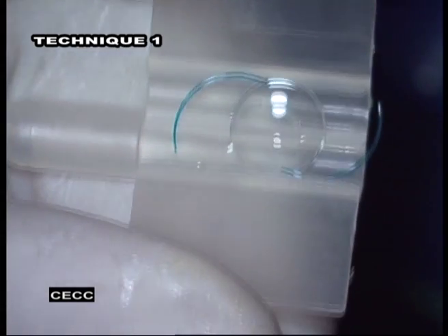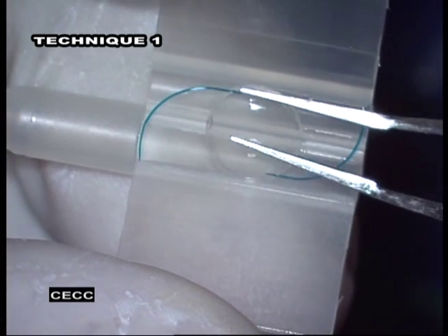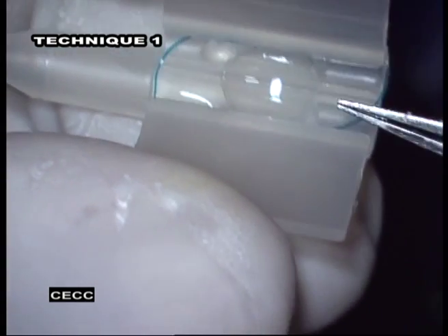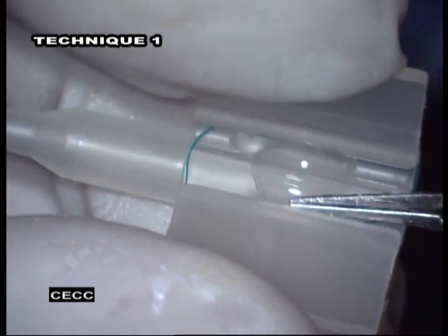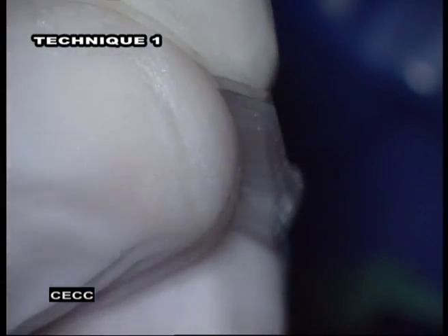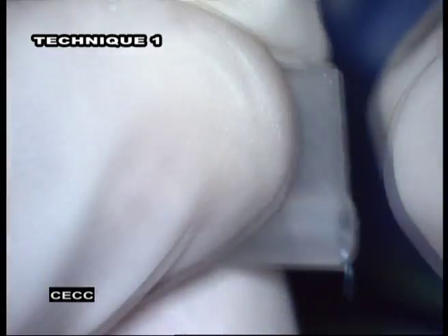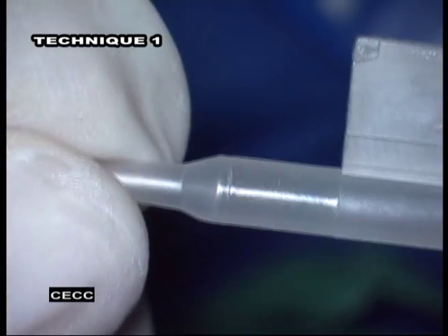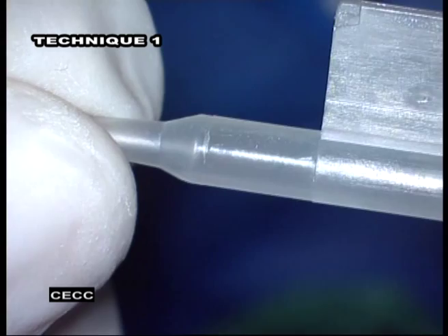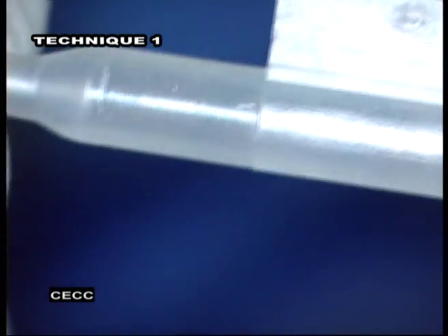Place the lens anterior side up across the central hinge of the cartridge with the haptics of the IOL corresponding with the IOL drawing on the cartridge wing. Place the leading haptic into the tube and the trailing haptic tip out of the end of the wings of the cartridge. The leading haptic should be visible with its tip pointing forward in the tube portion of the cartridge. Do not allow the leading haptic to be folded back in a loop. The tip of the leading haptic should be straight.